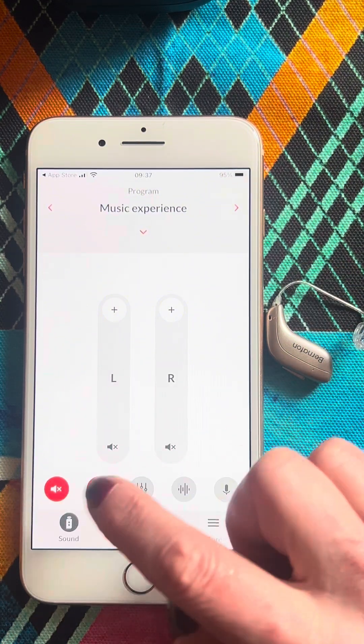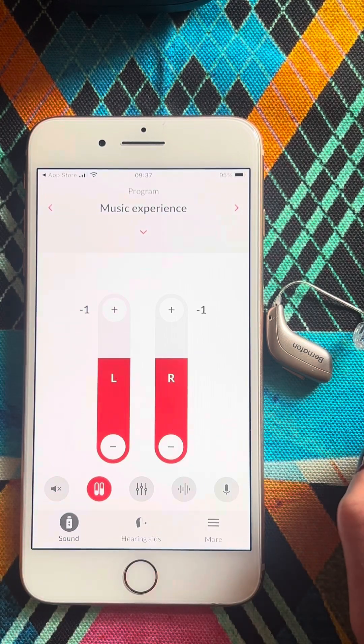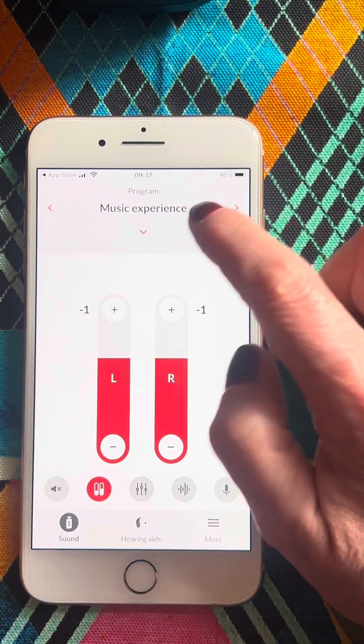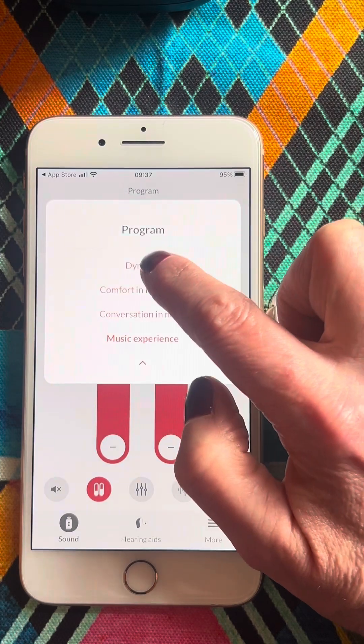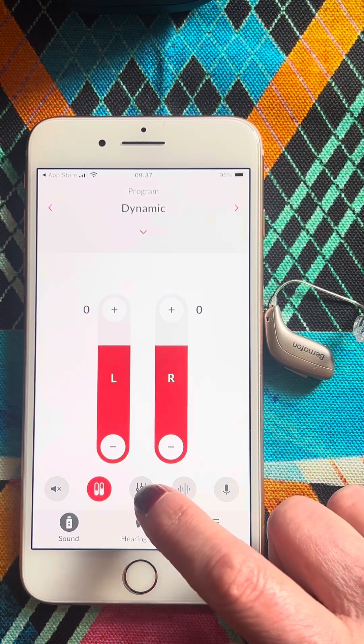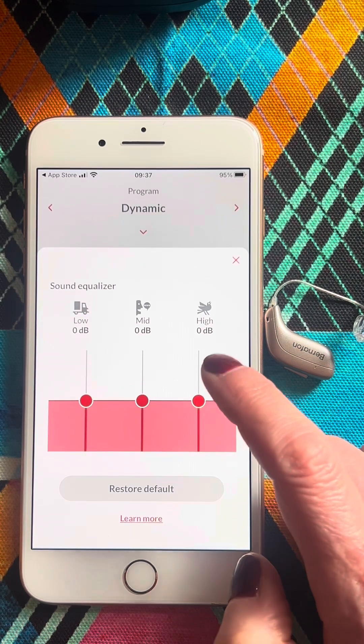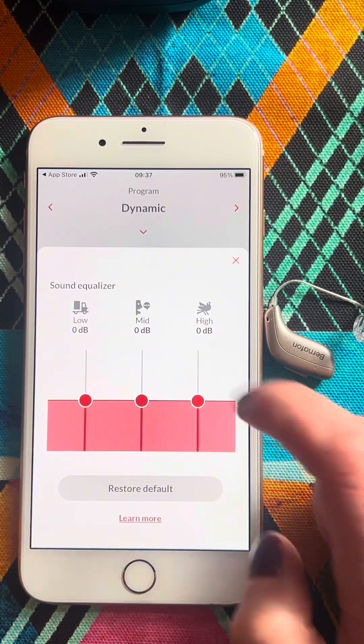If you want to mute the instruments, you press that button. To unmute them, you press this button over here. Dynamic is the master program. If you wish to alter the frequency response of the sound, you can slightly increase the trebles, mids, or bass.